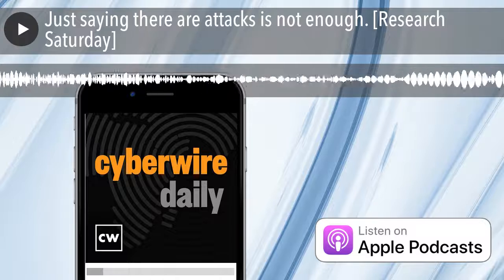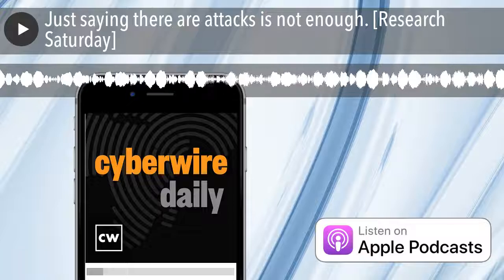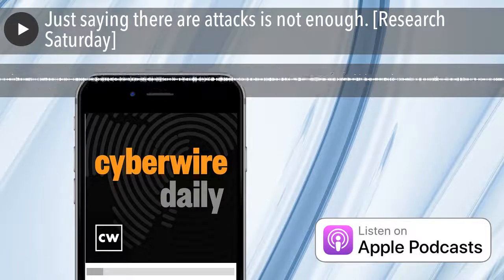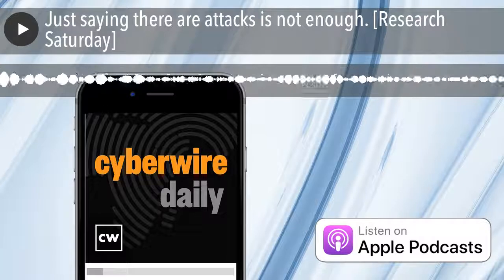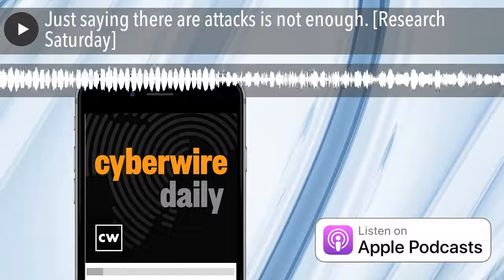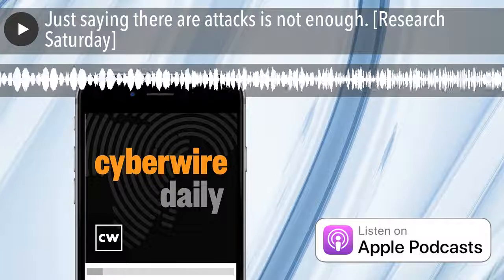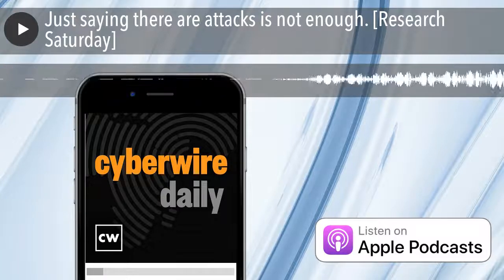Right. Yeah. So this means that you can monitor the network, but the host PC itself is a very, very closed system. It's still a normal Windows PC, but they can't really install endpoint security or even install updates on the computer because, let's say, a CT device comes in one piece. It comes with the host and the gantry and all the servers. They are all supplied by the manufacturer, and they have all passed the rigorous validation and regulations that I mentioned regarding safety. So if you install an update, the manufacturer must make sure that this update doesn't interfere with anything else that may compromise the device and may cause damage to the patient, even if it's just a security update.